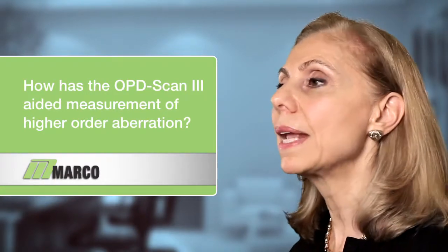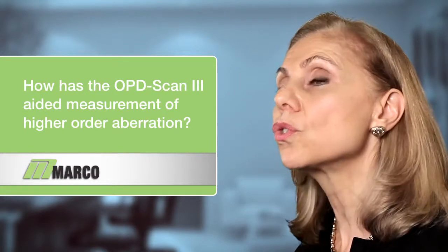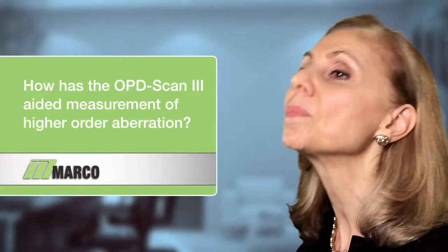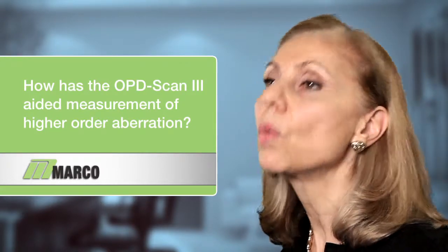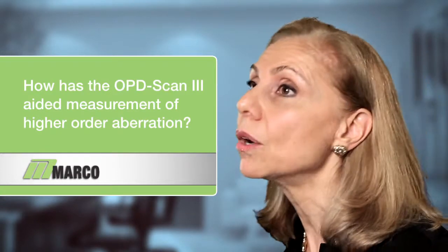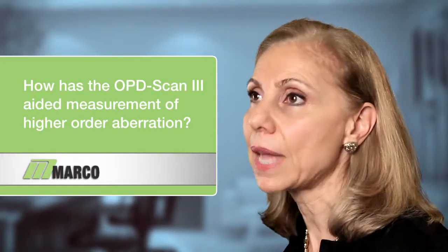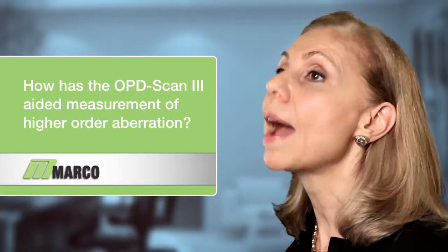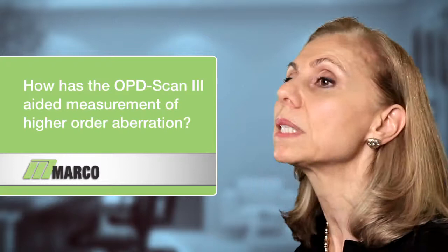And by demonstrating that at times, even after successful cataract surgery, they're going to have some residual, what I call feathering of a point of light. This way they are prepared. What I'm doing is I'm setting their expectations that they are not going to have a perfect pinpoint of light after cataract surgery because of their own higher order aberrations, which is part of their cornea, part of their visual system.